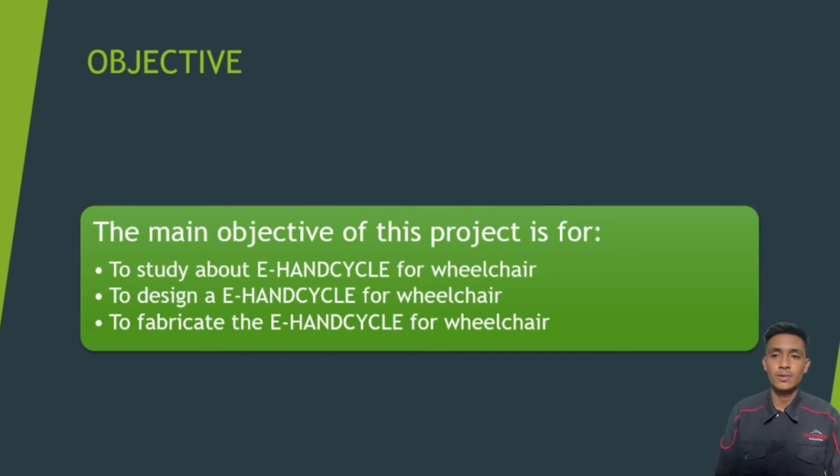The objective of this project is to study about E-Handcycle for wheelchair, to design an E-Handcycle for wheelchair, and to fabricate the E-Handcycle for wheelchair.